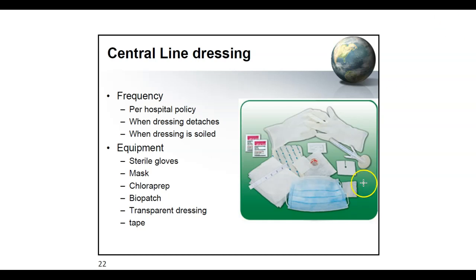Make sure that you have a ChloraPrep to disinfect the area unless they are allergic to it or they get a reaction, but usually that's what you use. And then you have a bio patch. I can't see it over here, maybe it's too small, but a bio patch looks like a little disc. It goes around the insertion site, and it's basically a patch that prevents bacteria from growing in that area. And then you also need your transparent dressing and tape to secure the device even better.